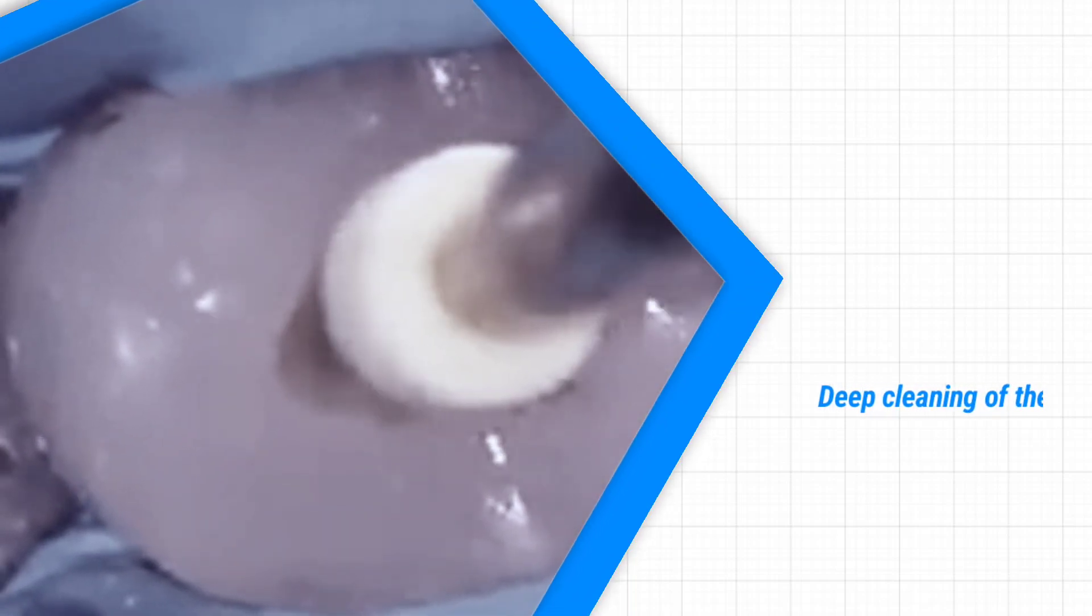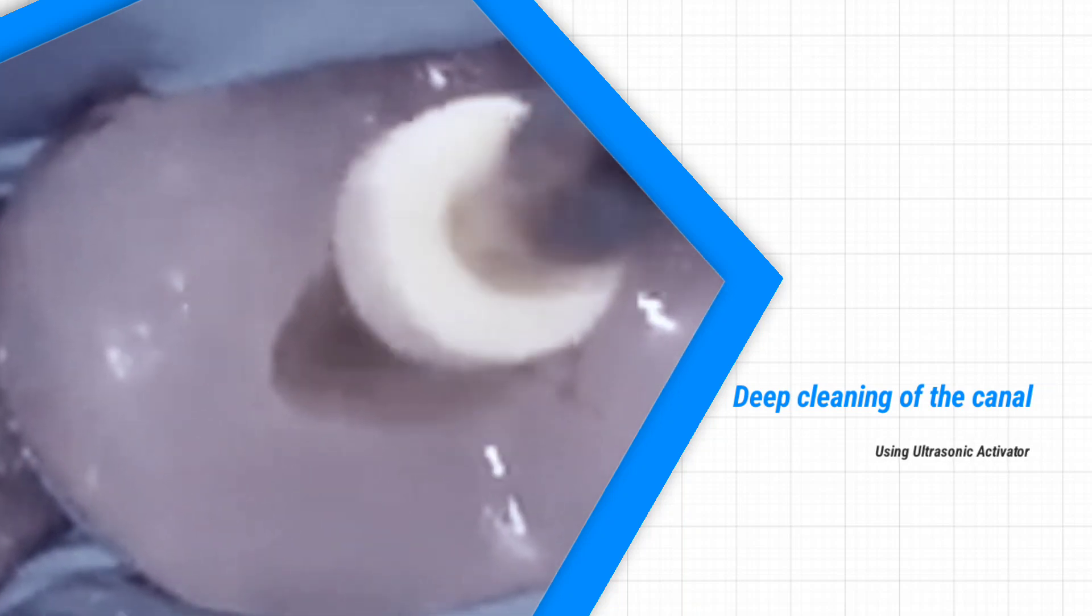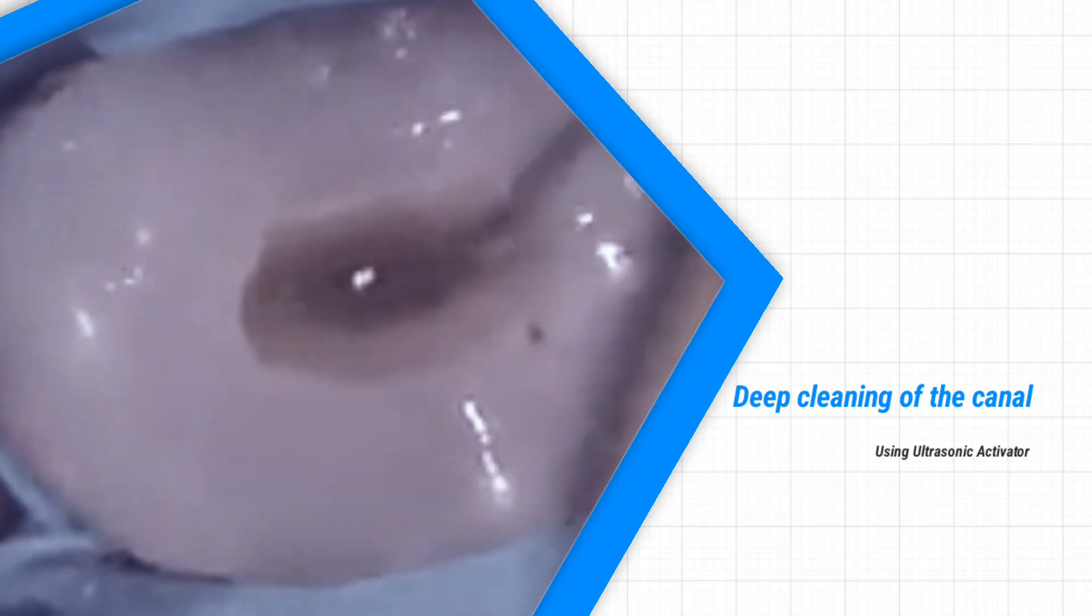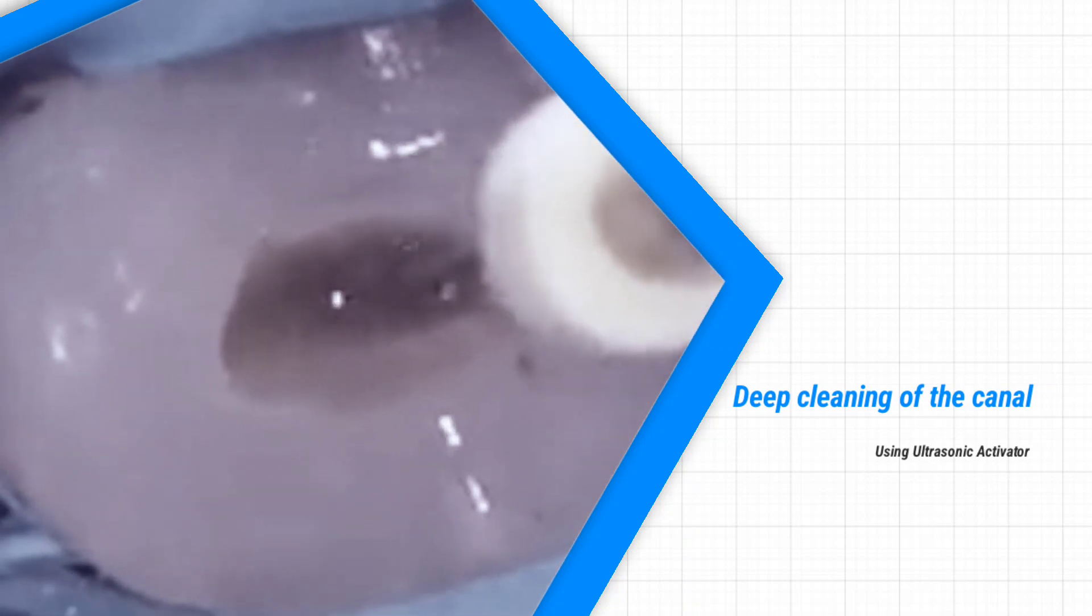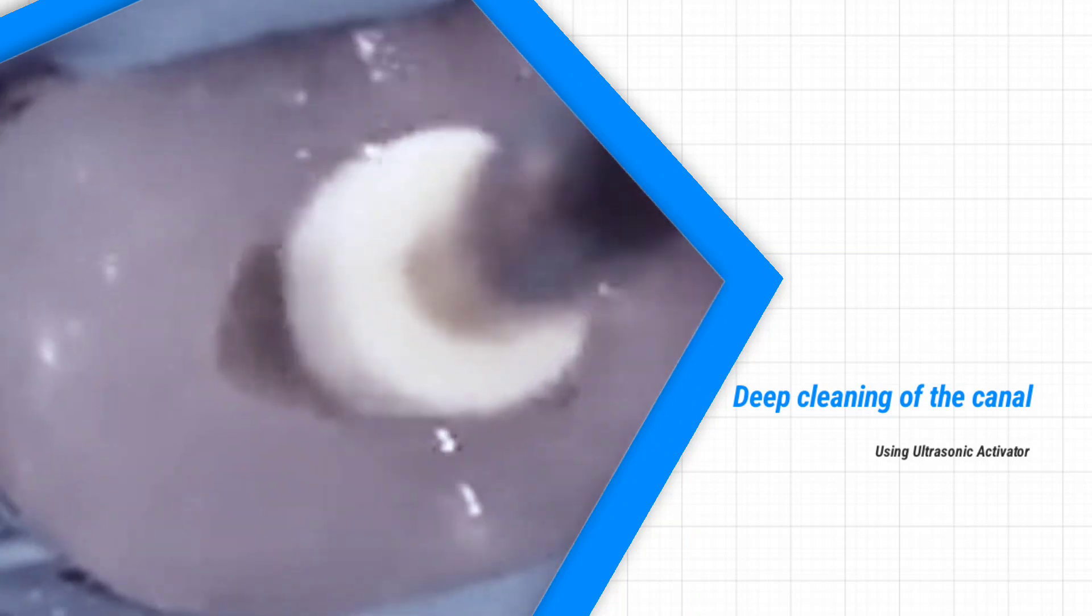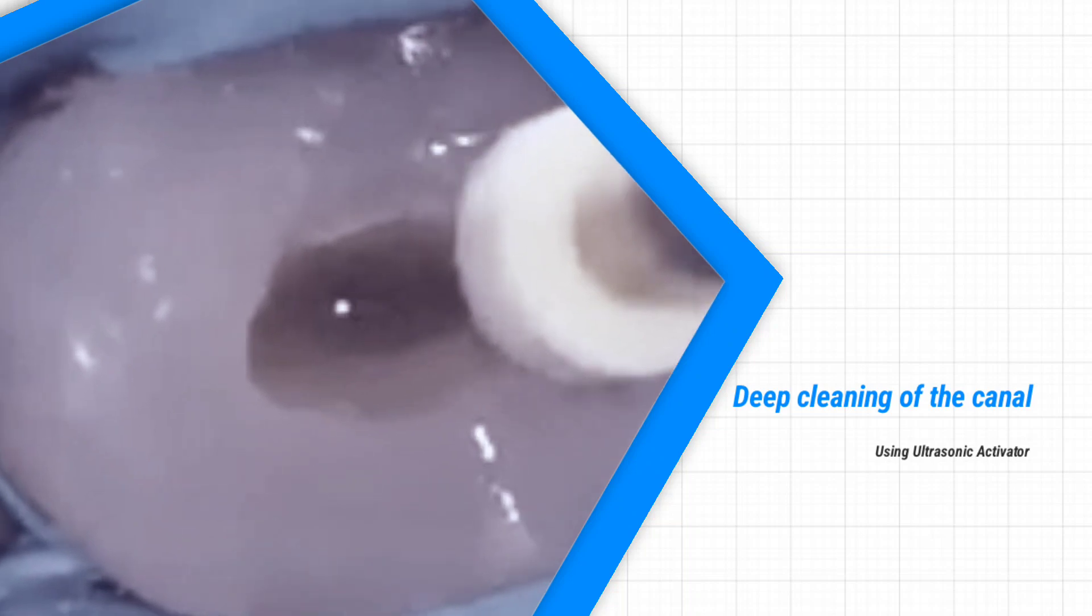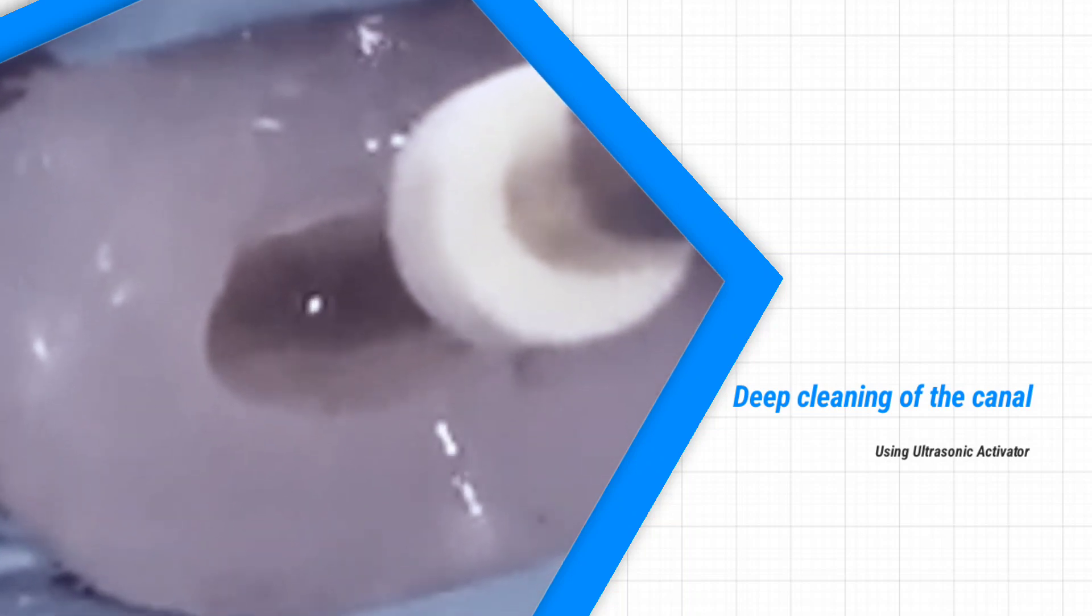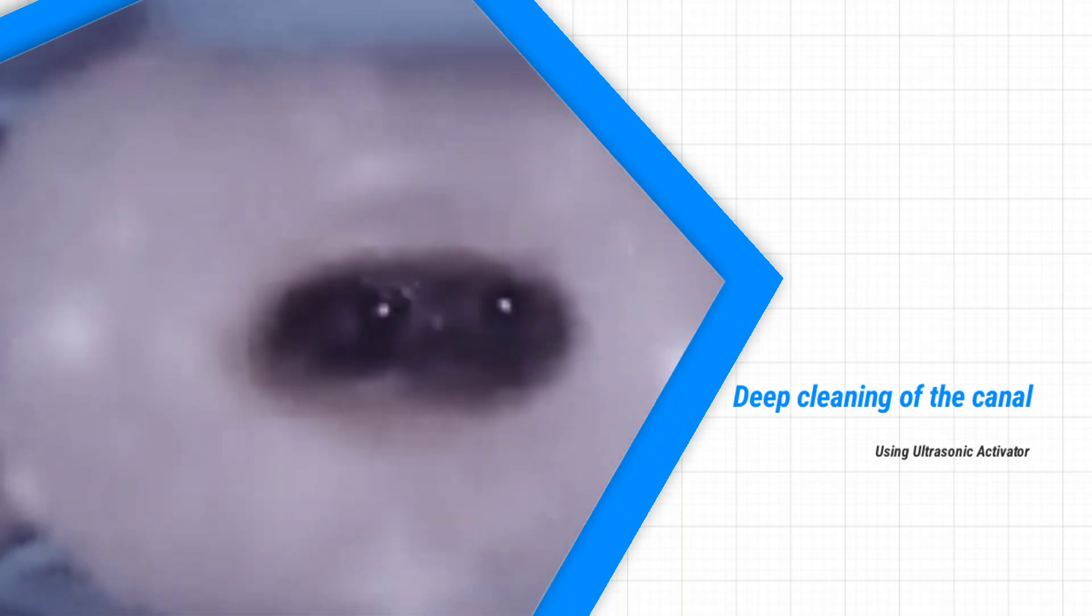Ultrasonic irrigation device removes the residues with high frequency vibrations. Under the action of acoustic streaming, the root canal is cleaned well and it facilitates 3D obturation and long-term success. It causes activation of the irrigating solution and helps in deep cleaning and disinfection into the lateral canals, fins and webs.